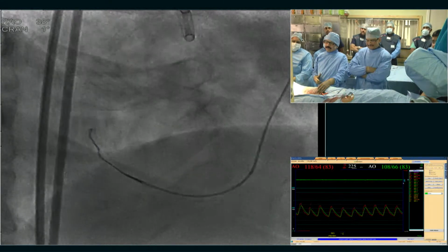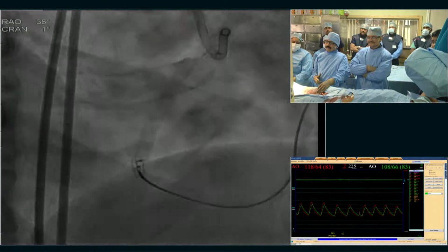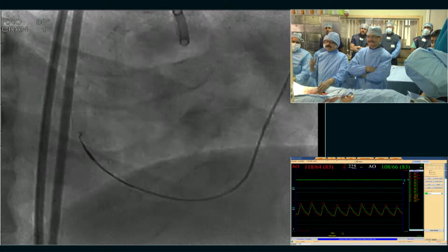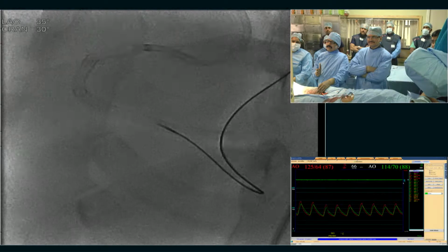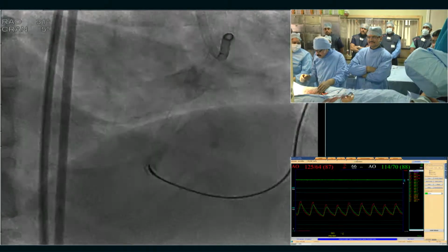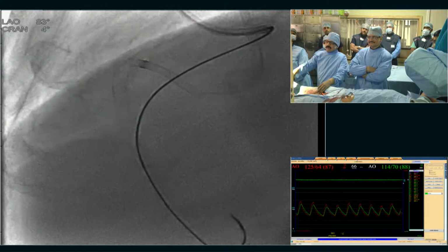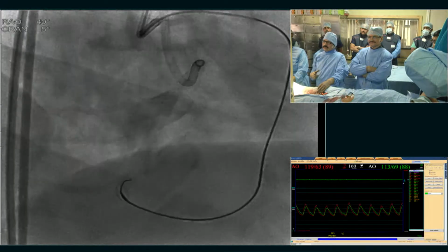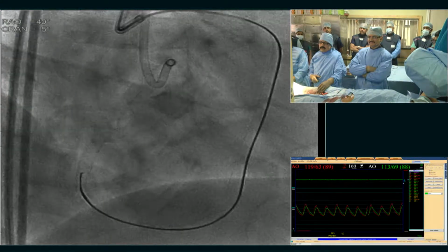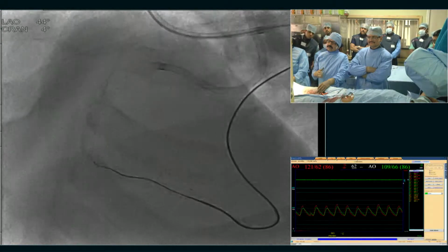Then the wire goes up inside the stent. We checked in RAO and LAO views mostly, and once I find the lateral view also very good in RCA CTOs. Here we preferred all three views. But negotiating the Corsair is impossible even with a good backup of the EBU catheter. It's a very tough tissue, and I could not enter the tissue.